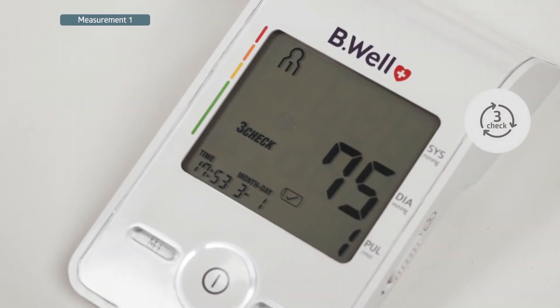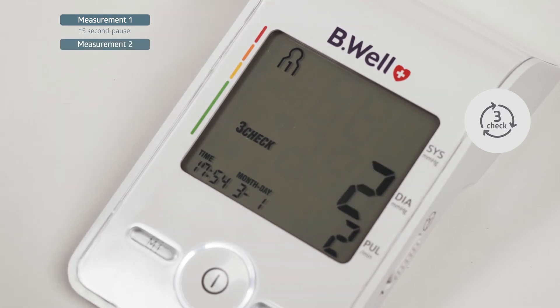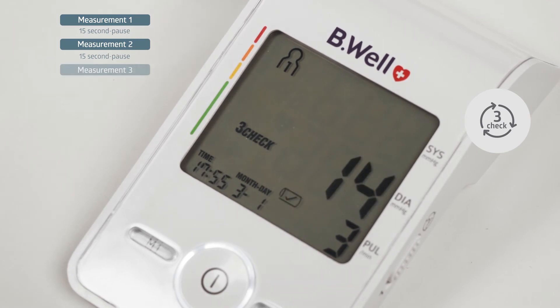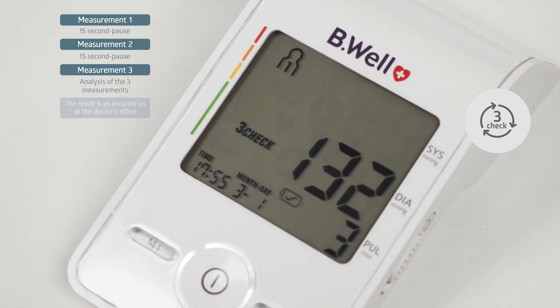In the three-check mode, the tonometer ensures advanced measurement accuracy. The device automatically makes three consecutive measurements at the required interval and analyzes the results according to a special algorithm. If any measurement is detected as inaccurate, it will automatically take an additional fourth measurement. Blood pressure is constantly fluctuating — excitement, fatigue, and arrhythmias all affect the reading. The three-check technology is created in accordance with the blood pressure control recommendations of the World Health Organization.